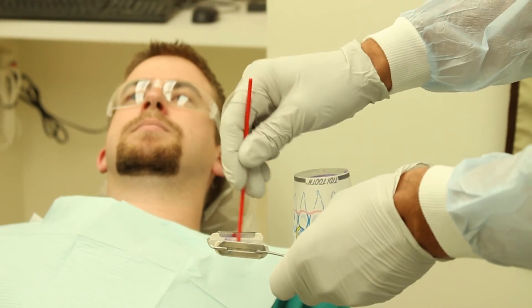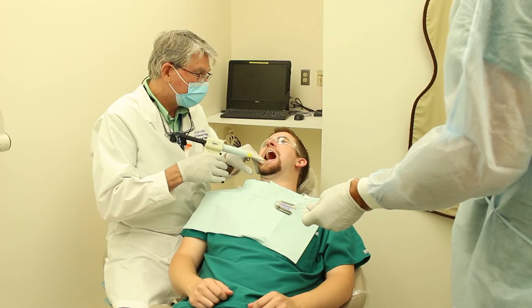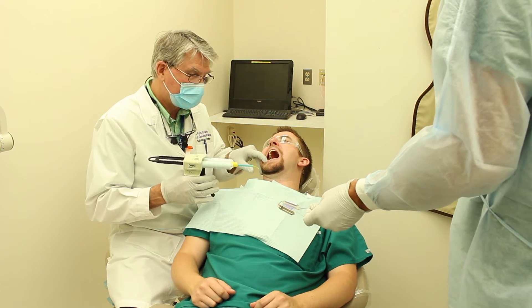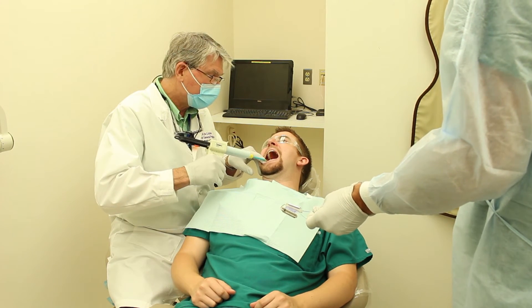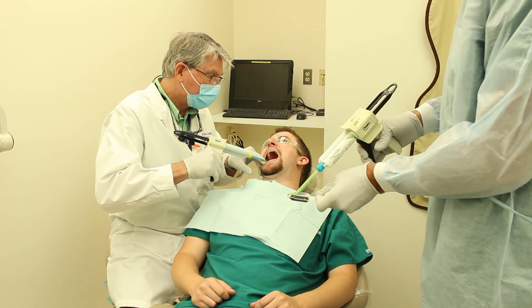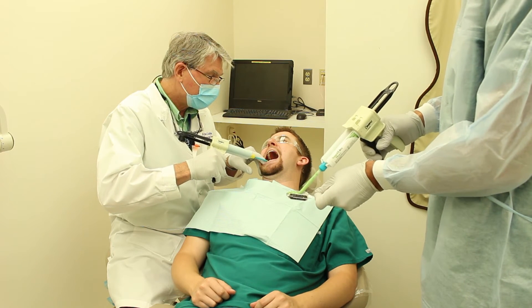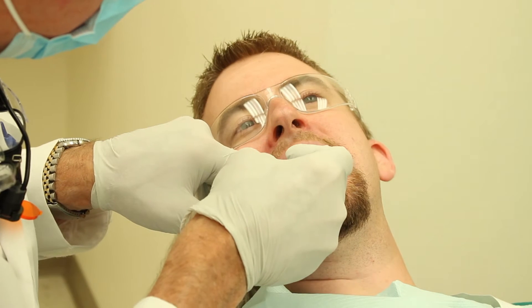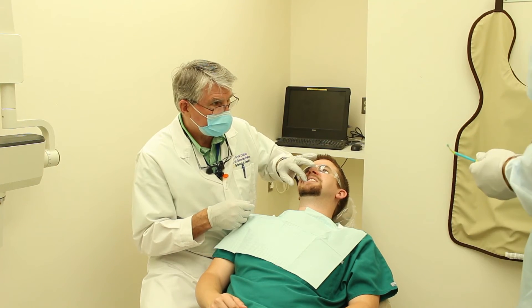Take the tray out of the mouth and put the adhesive on the mesh. Then get the tooth ready for the impression: take your retraction cord out, dry the area, and put your syringe or light body material around the tooth. Put your heavy body material on both sides of the dual arch tray, insert it into the patient's mouth, have them close together, check their occlusion, and look at your reference point to make sure they're biting together like they normally do.